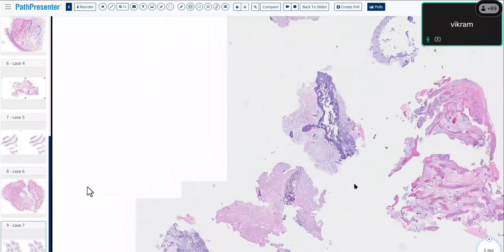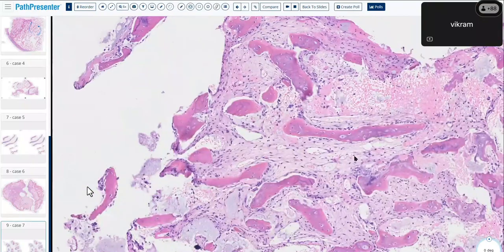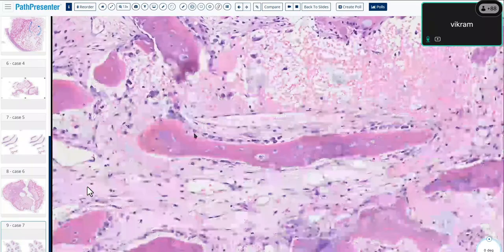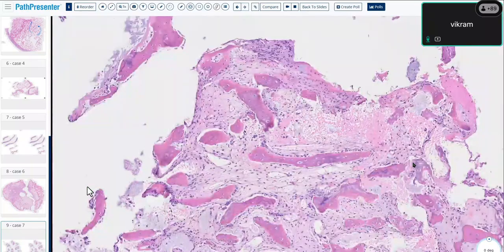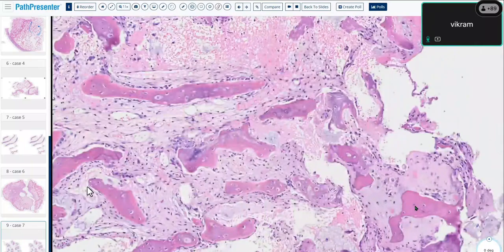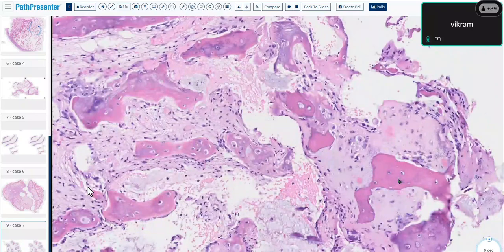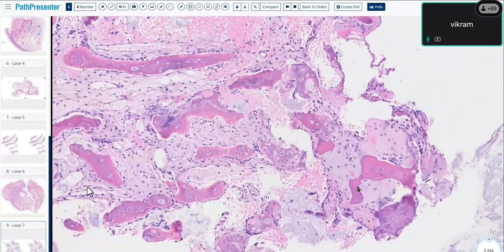There are other pieces of bone here which are completely reactive, and I wanted to point that out to you. Look at that, this is osteoblastic rimming. So this is the result of a fracture. In fact, on other sections, there was evidence of a fracture callus. Somebody seeing entrapment may be seeing a fracture callus. So there was a fracture callus because there was a fracture. There was enchondroma, that's the low-grade component. Then there was the high-grade component. And then there's osteosarcomatous differentiation.